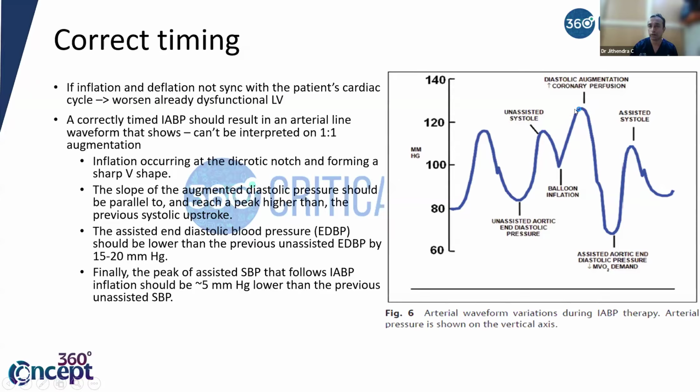So your diastolic augmentation will be more than your unassisted systole. So what is the help of that? That is what is doing your coronary perfusion. That is what is improving your coronary perfusion. So that is the thing.